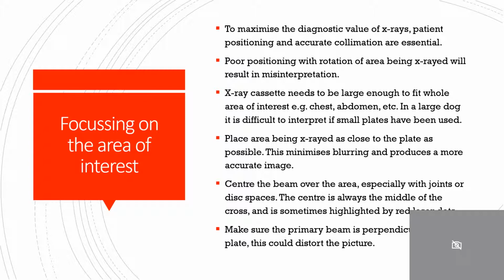So if we were to use small plates when X-raying a large dog, again that would make it difficult to interpret. We should place the area that's being X-rayed as close to the plate as possible to minimise blurring and produce a more accurate image.